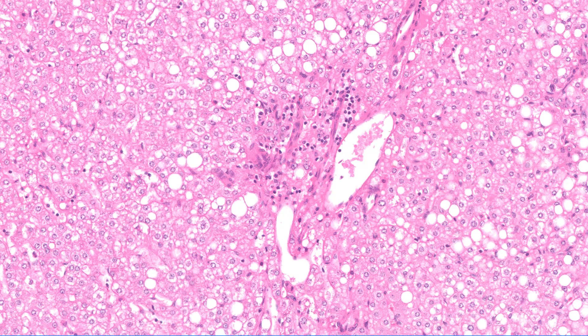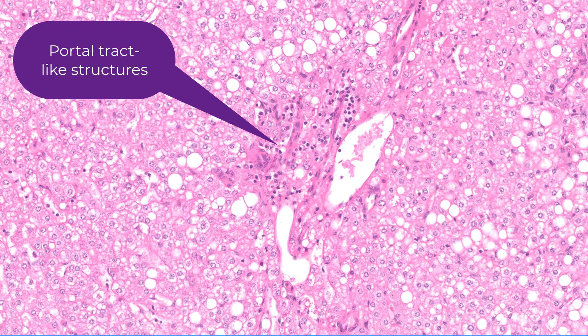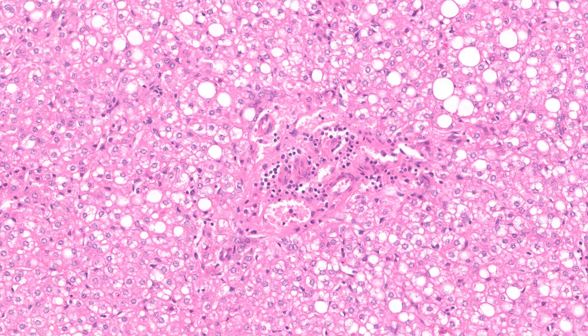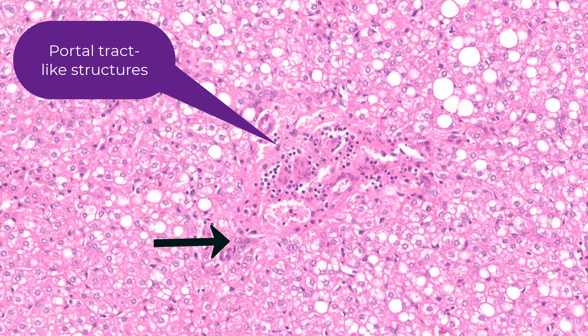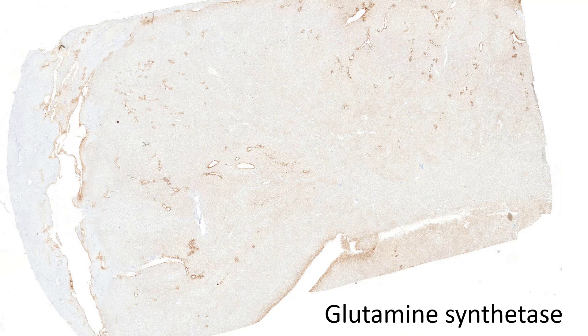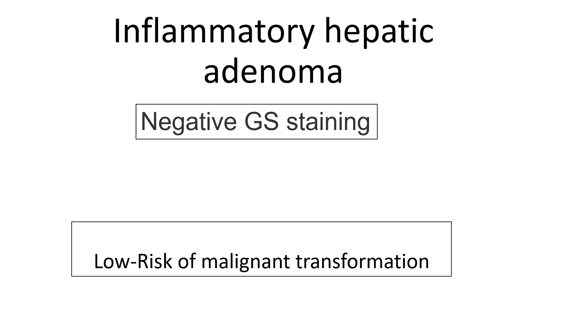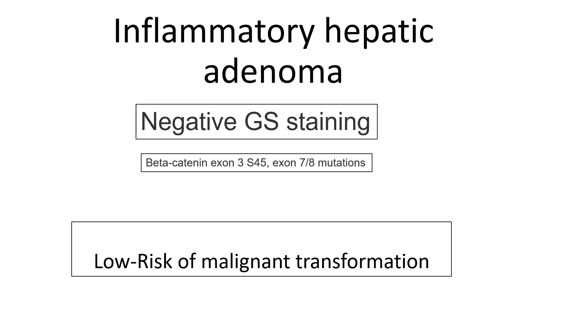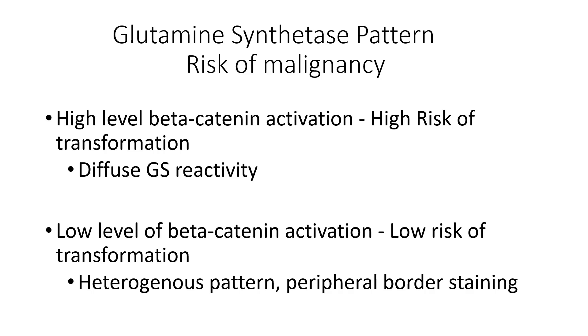One final case: a 45-year-old female with portal tract-like structures. There are certainly inflammatory cells and naked arterioles. Here's another portal tract-like structure, and perhaps a bile ductule right here. The SAA stain works really nicely here — notice this diffuse, strong reactivity for SAA. This is an inflammatory type hepatic adenoma. The glutamine synthetase stain was essentially negative, which implies that this would have a very low risk of transforming to HCC. A negative GS stain implies a very low risk of transforming to HCC, and that typically corresponds to these kinds of beta-catenin mutations.